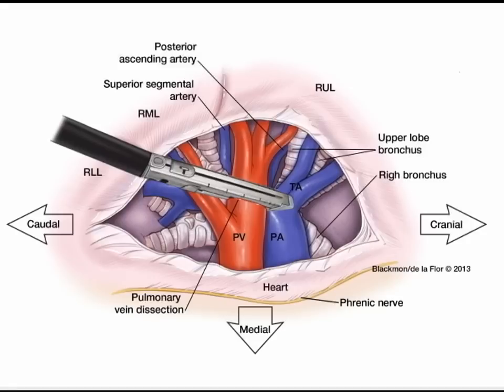Whatever technique you use will allow you to encircle the upper lobe branches of the pulmonary vein. A passer may be used to facilitate passage of a stapler, and once the stapler is safely passed completely around those branches with the cut mark past the superior aspect of the pulmonary vein, you can then staple and divide the upper lobe branches of the right superior pulmonary vein.